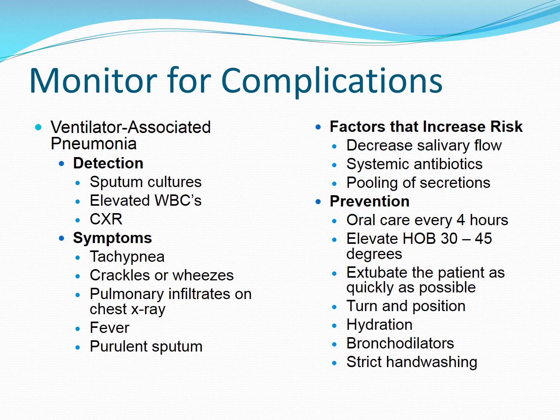Extubate as quickly as possible, and I just mentioned that. As I said, they try to minimize sedation and try to do these spontaneous breathing trials to try to get the patient off the ventilator a lot sooner. Turning and positioning and hydration, those all help to mobilize secretions so we can get those secretions out of that lung. Bronchodilators, and very good hand washing.